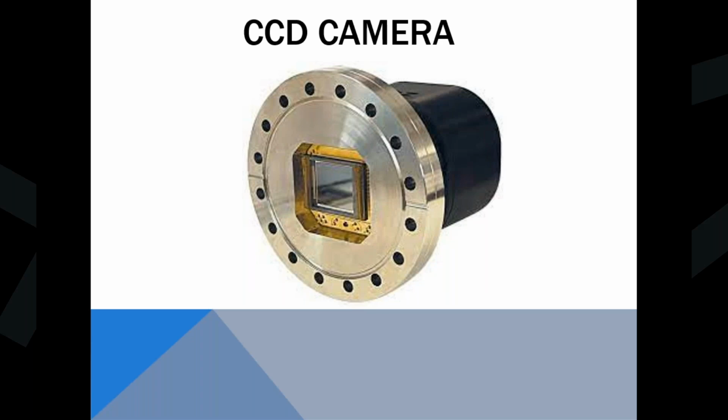And these were really good. The image quality wasn't quite as good as a pickup tube, but they didn't take as much heat, and they didn't take the time to warm up like the pickup tubes. So they were, I guess, kind of off the shelf, ready-to-go imaging.